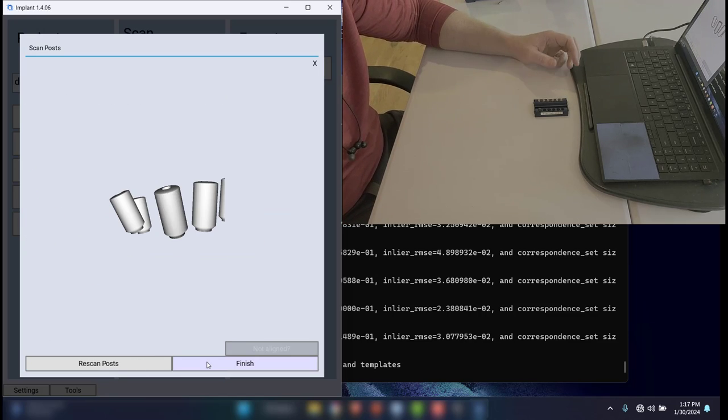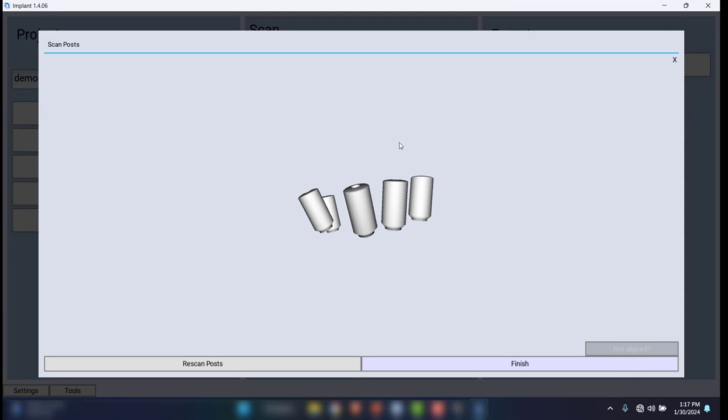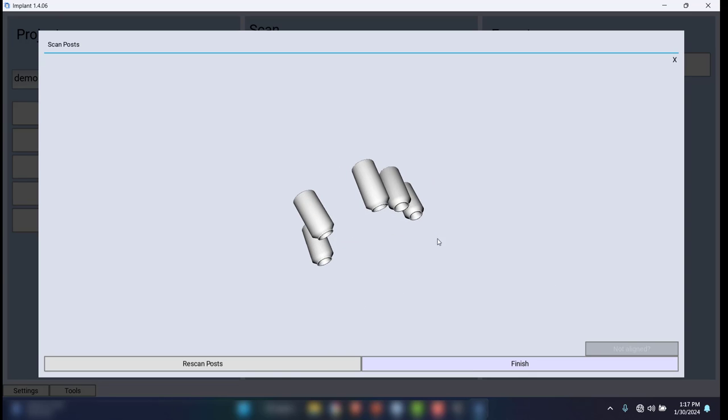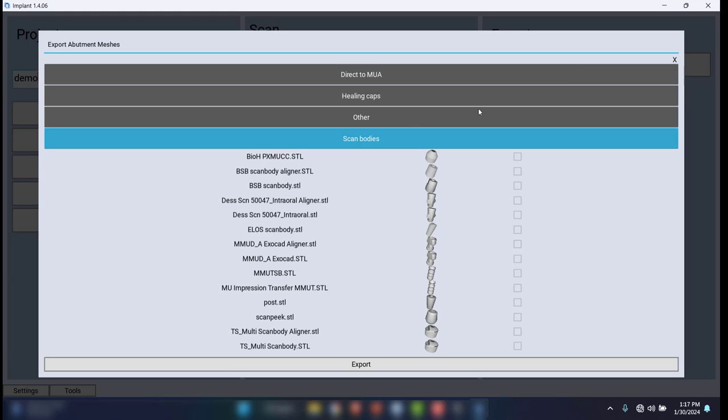If I click next now, and at this point I'll shut down the camera and just show you my computer screen. Here's the data that it captured. There's all 5 implant positions. All right, if you wanted to rescan, you can do that now, but everything seems good. I'm going to click finish. And now all that you would have to do, if you had an opposing arch, now you could capture lower posts. All I need to do now is export the abutment meshes. All right, so I'm going to go to export abutment meshes.